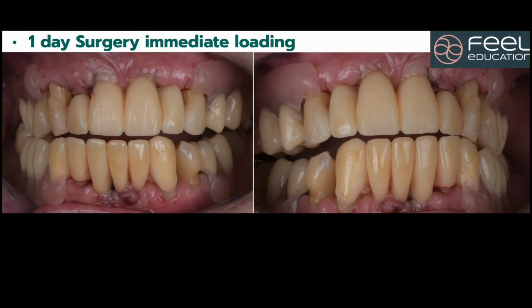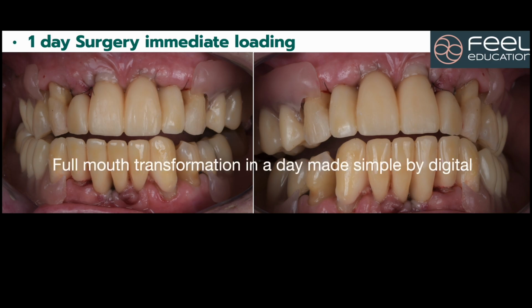The idea is that because everything has been done before, when you go for the surgery, when he goes on the left side, on the right side, it works. You don't have to touch anything, or make a small equilibration, which is normal, but you can be confident in the realization of the prosthesis.